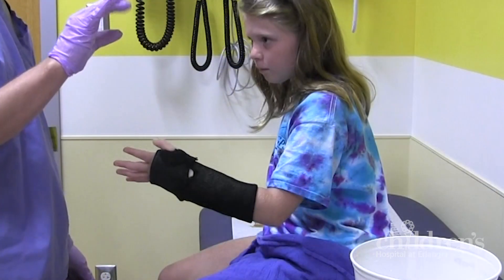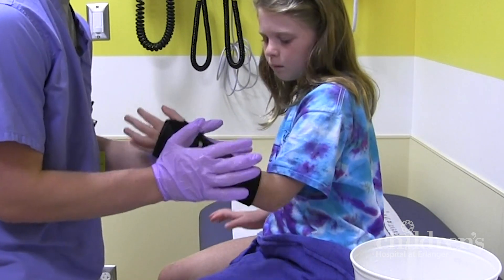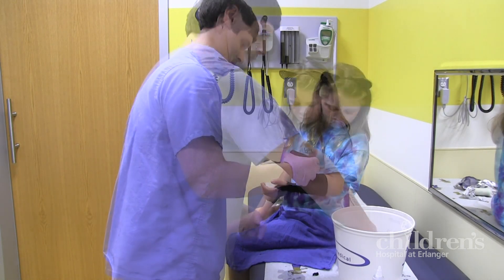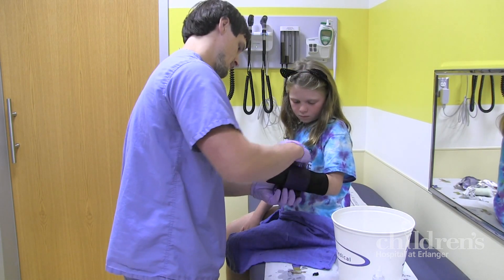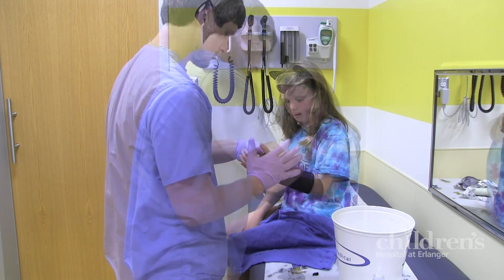Before starting the last layer, we'll make sure you can still wiggle and use your fingers or toes. This last layer will be the color you selected. The technician will dip the wrap in water and start wrapping. Some kids tell us the last two layers feel warm as the casting material hardens.